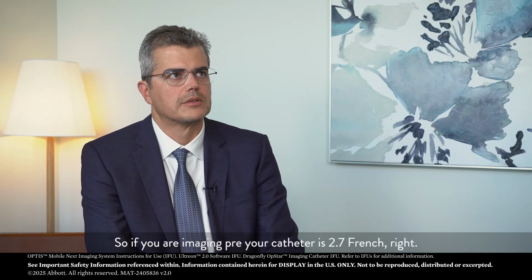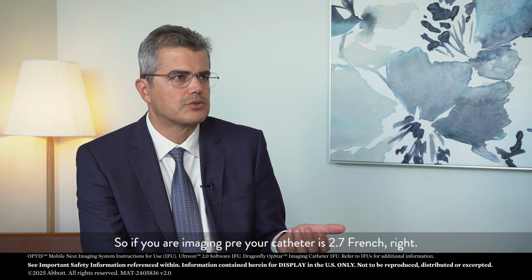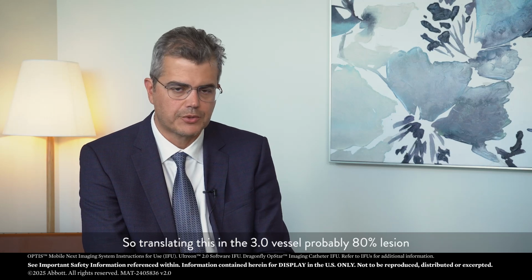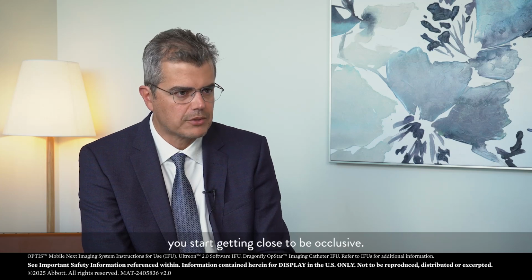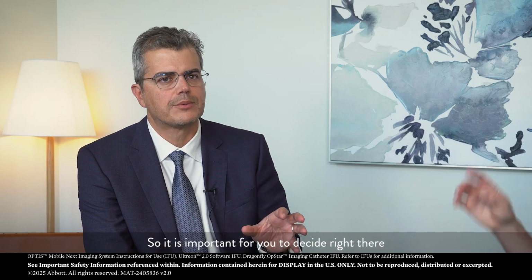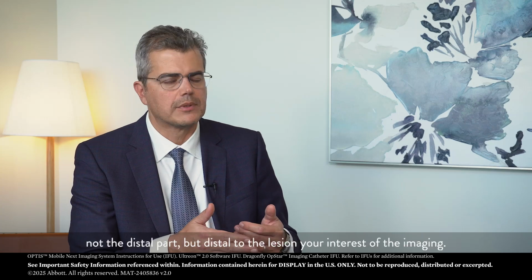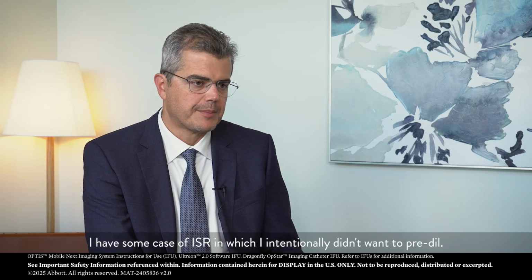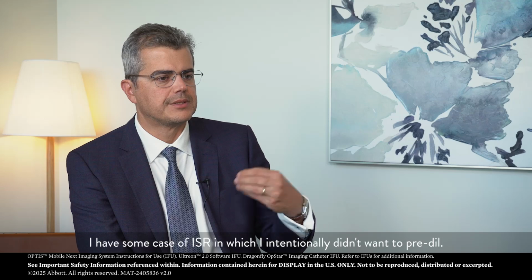Very important as well. So if you are imaging pre, your catheter is 2.7 French, right? So translating this in a 3.0 vessel, probably 80% lesion, you start getting close to being occlusive. So it is important for you to decide right there how important is the distal part of the vessel, the part distal to the lesion, to your interest of imaging. I have some cases of ISR in which I intentionally didn't want to pre-dilate.